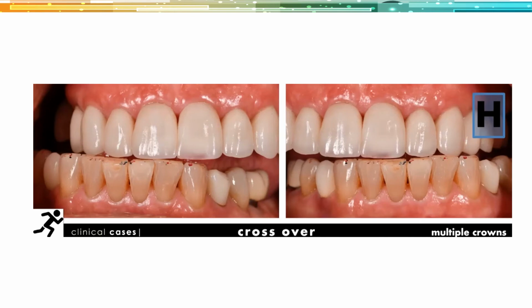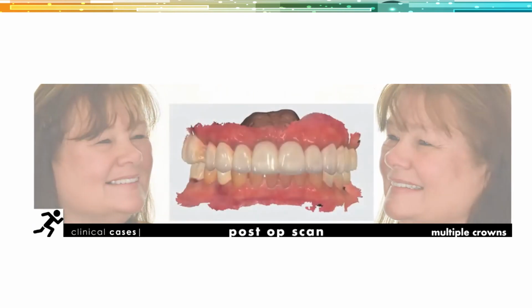And so it's more than just using the scanner, but also using all of the knowledge that we have and we've built. The other things that I do at this 1 week visit is I'm also going to take final portraits now that the tissues have healed. But most importantly, what I want is a post-op scan. And so this is the final milestone scan of the finished product. The patient is happy. We're happy. We've adjusted all the occlusion, and everything is just where we want it.